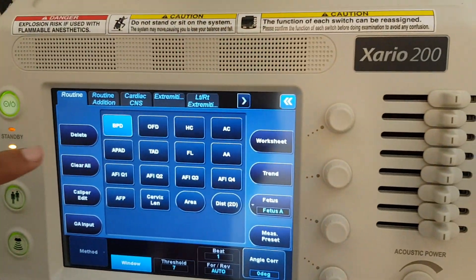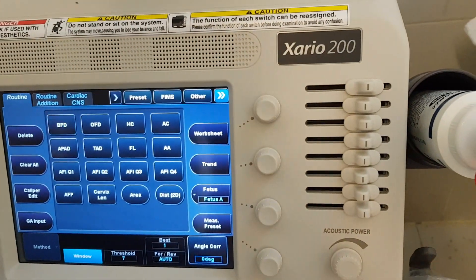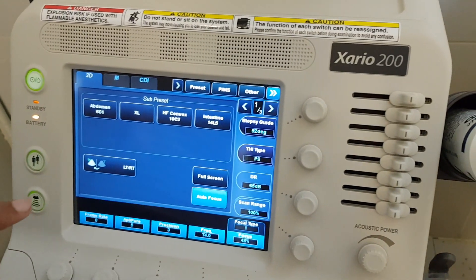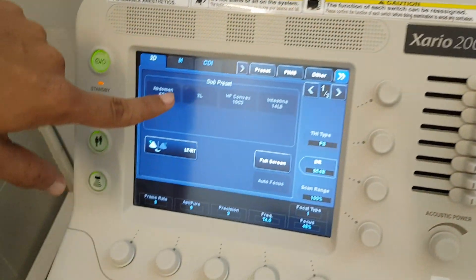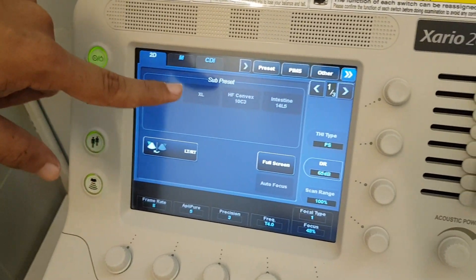I will show you this again. In the presets, when we freeze in abdomen mode, there is no such measurement option. That's why we have to use presets.